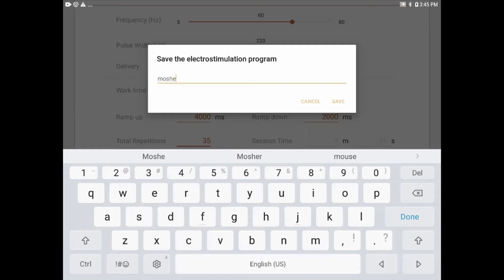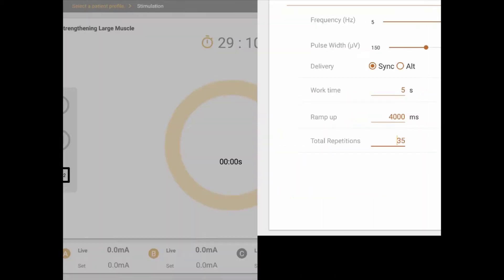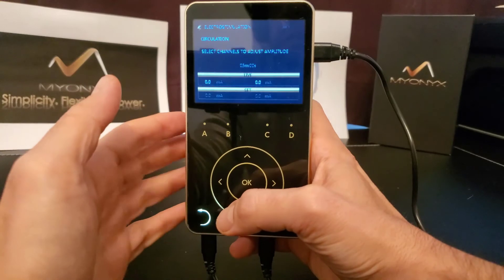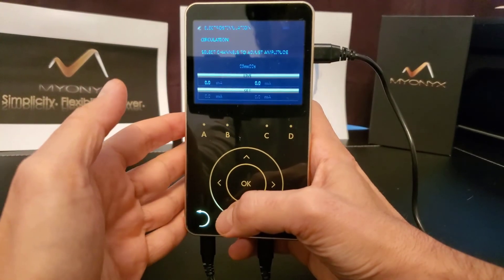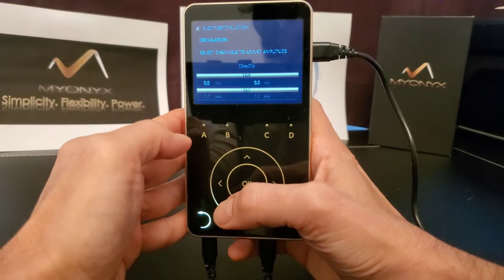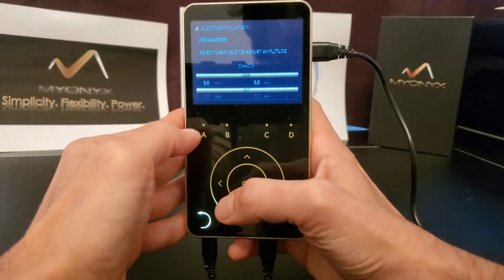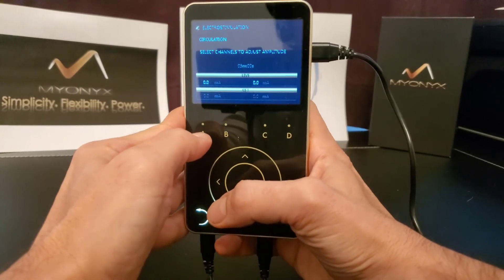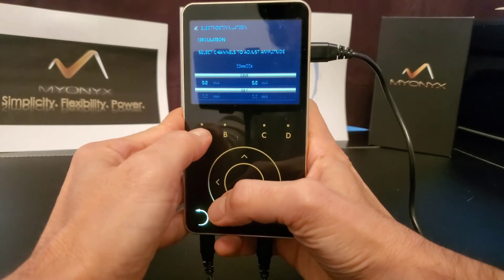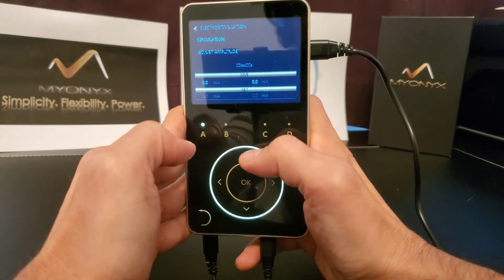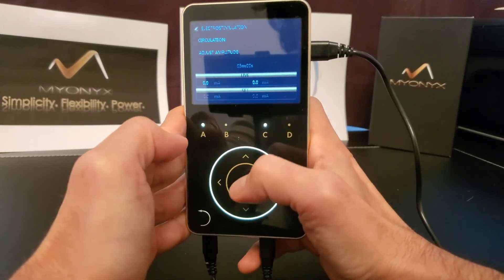Before starting an electrostimulation session, the user must adjust the amplitude level. For safety reasons, this is done on the Mionics device itself. On the device, click on the letter representing the channel you wish to adjust. You can select one or more channels at the same time.